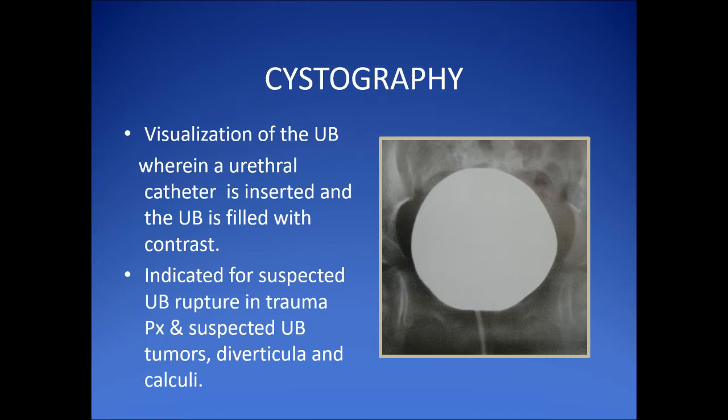And then there is also what we call a cystography. This is a study of the urinary bladder. A urethral catheter is inserted and then the contrast material is pushed. This is used if you are looking for any rupture of the urinary bladder in trauma patients or any suspected tumors, diverticula or calculi.